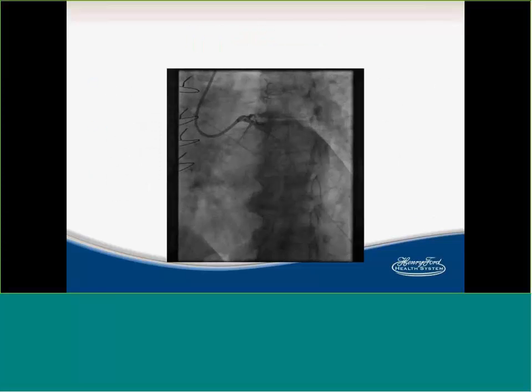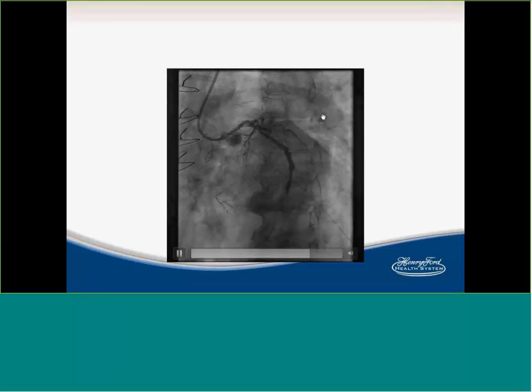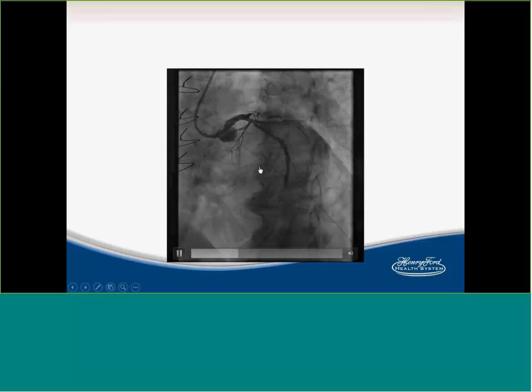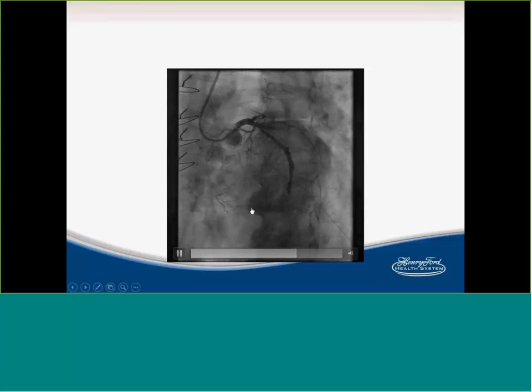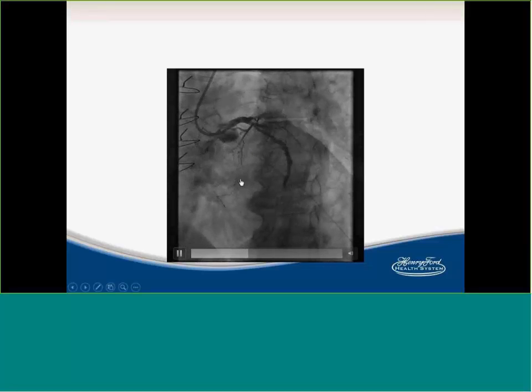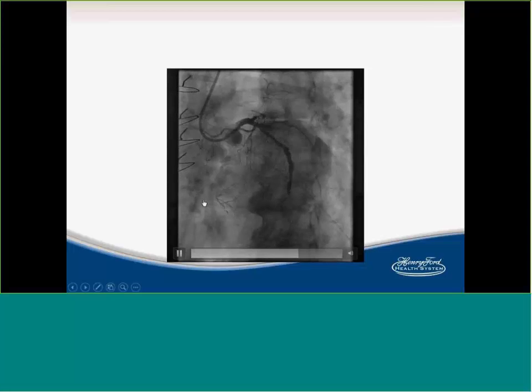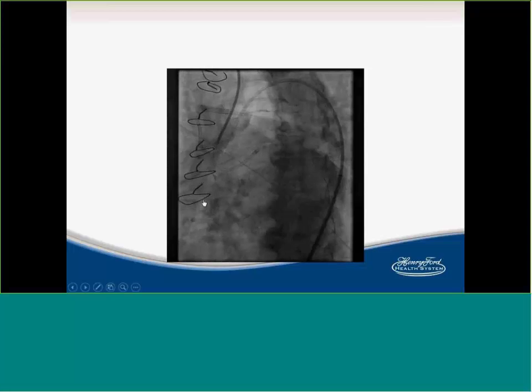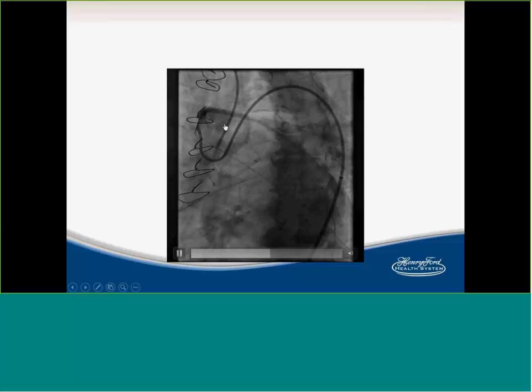And this is what happened with this patient. We brought him back in about 4 weeks, and this is basically the vessel. This is the result of basically knuckle and just ballooning. So the RCA, you can see the RCA is still occluded here. The septals that I used, they're still feeding the RCA. And so at this stage, this graft, this is the picture of the graft in here.